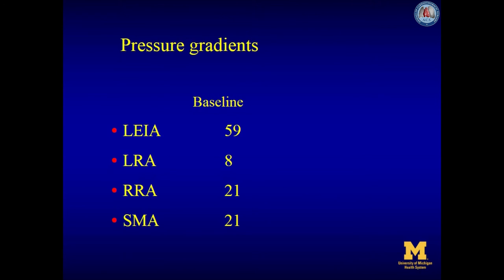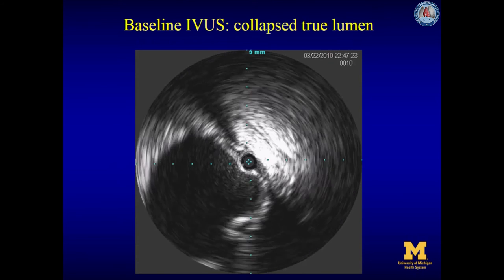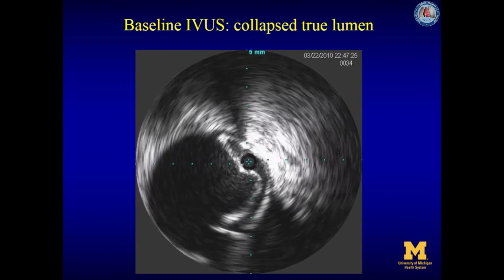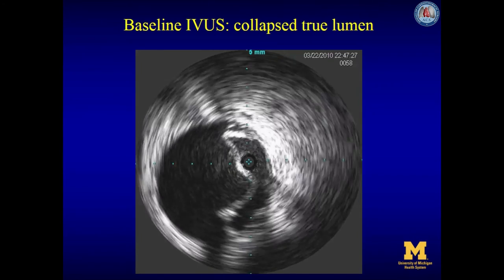These are the baseline pressure gradients of the different visceral branch vessels: the left external iliac artery, the left and right renal arteries, and the superior mesenteric artery. Those gradients are measured with one catheter in the aortic root in the ascending aorta and the other catheter in the trunk of the particular visceral vessel. This is now a focused IVUS better oriented on the visceral segment.